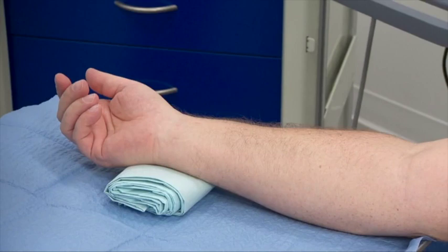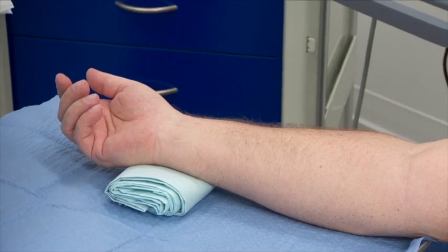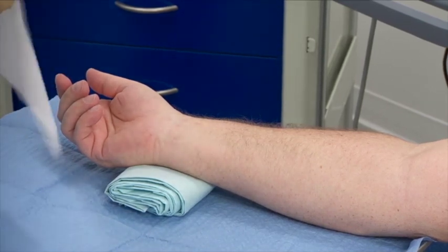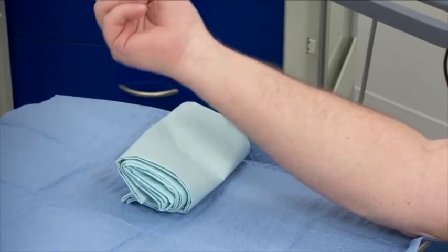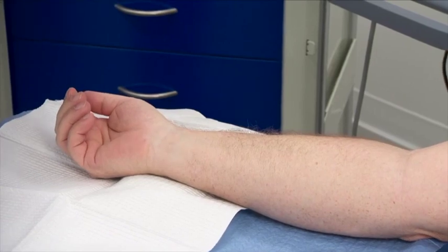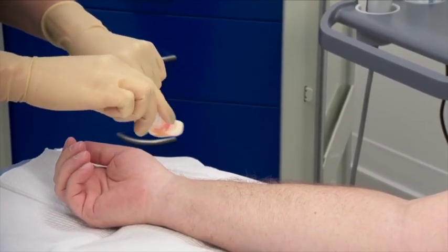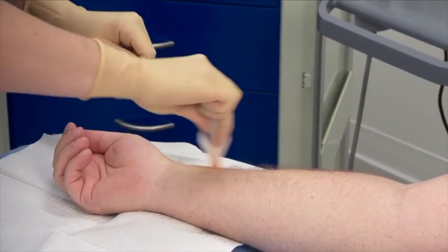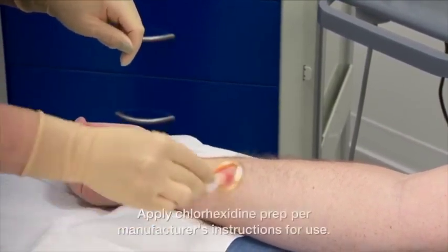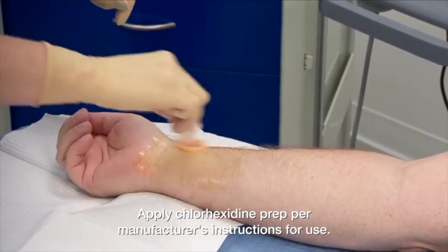Next, prepare the extremity for insertion. Position the wrist in dorsiflexion to bring the artery in closer proximity to the skin. Prep and drape the insertion site per hospital protocol. As part of any CLABSI prevention bundle, use a chlorhexidine-based skin prep as recommended by the CDC guidelines. Use a scrubbing motion to create friction. Be sure to prep and allow the proper drying time per manufacturer's instructions for use.